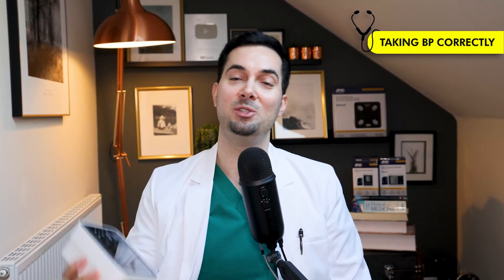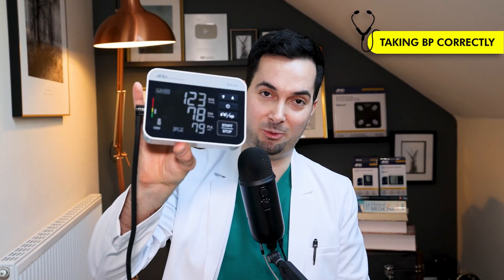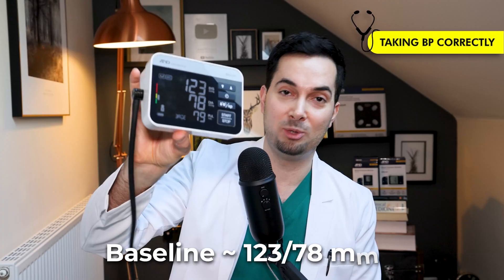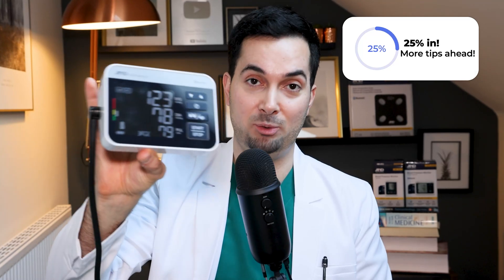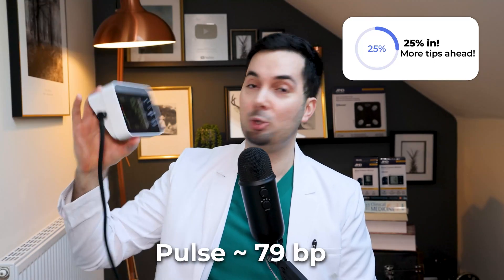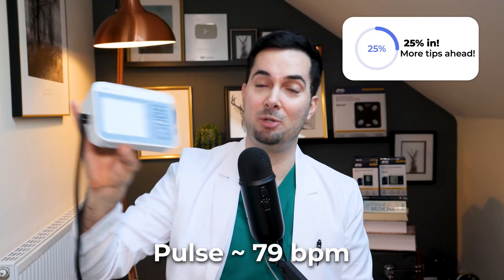Now that I've taken my blood pressure using the Try Check technology, you can see my reading: 123 over 78 millimeters of mercury. That's my baseline blood pressure — 123/78 — and my pulse is 79. It's a pretty good blood pressure. Now let's begin with the experiments.